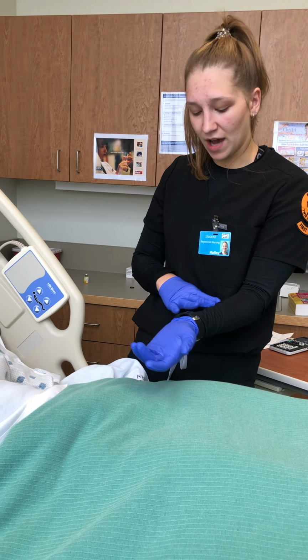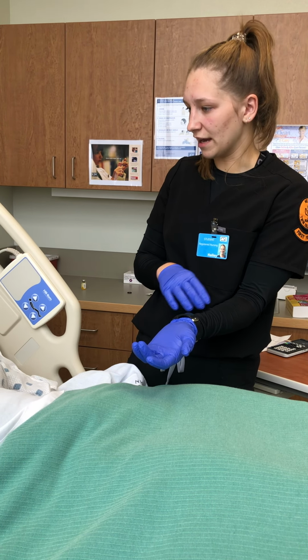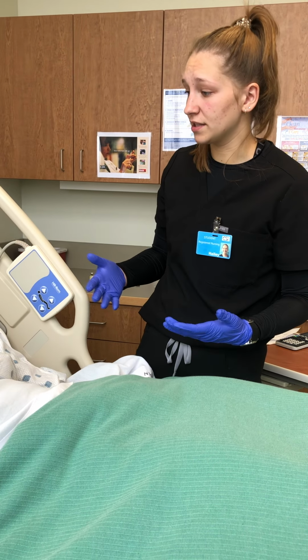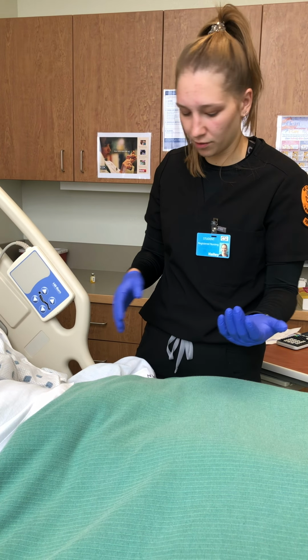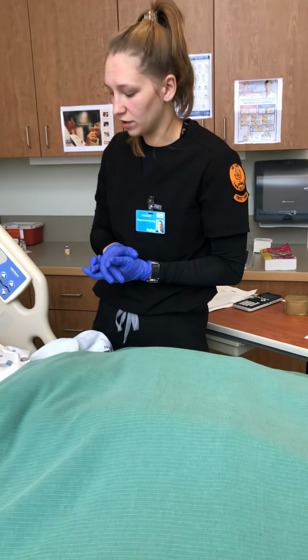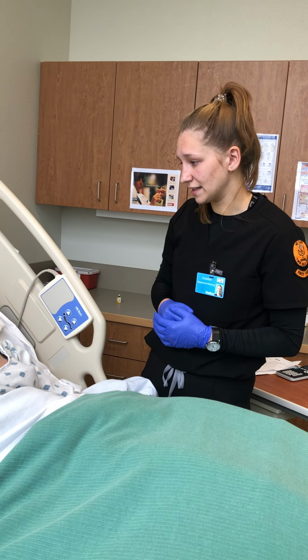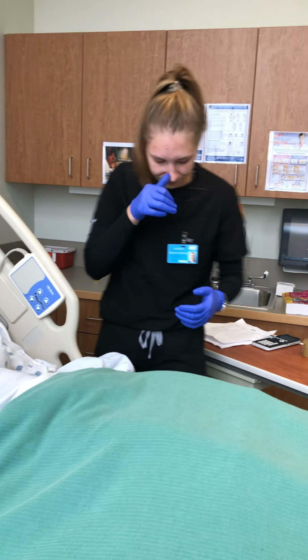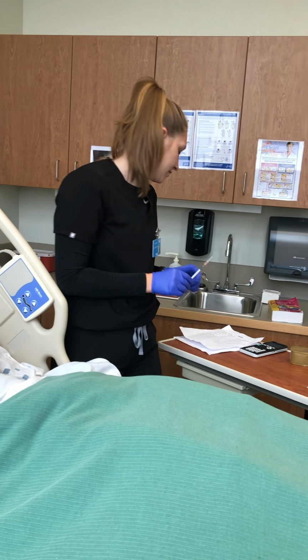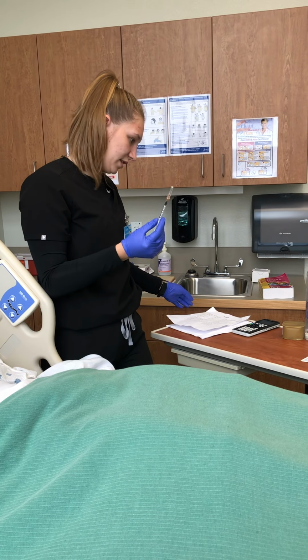And we're going to check to see if you have a reaction to it. If you have any redness, red bumps there, it's itchy, it's swollen, or anything at all, we're going to go ahead and follow up with some tuberculosis precautions. But if we come back and check it and it's completely normal, then that's all good and we're in the clear. I know you've been traveling recently. Have you had the tuberculosis vaccine at all? No? Okay. So I'm just going to go ahead and do my third check on this. I need 0.1 milliliters, and I have 0.1 milliliters within the needle.